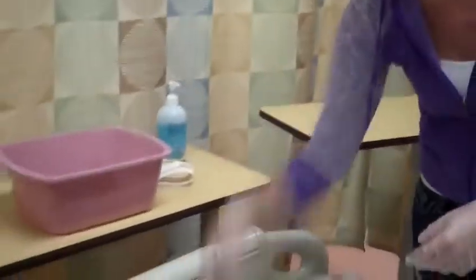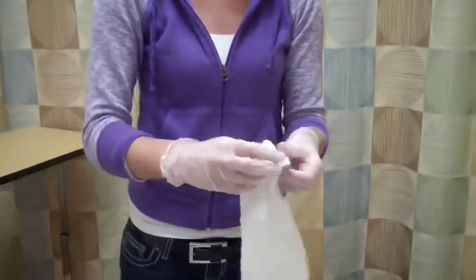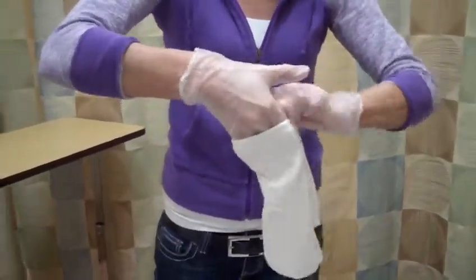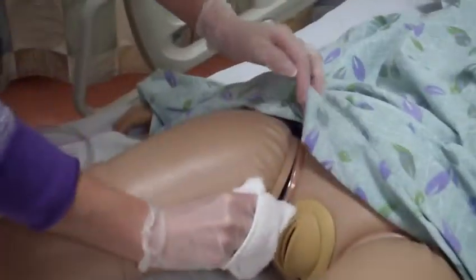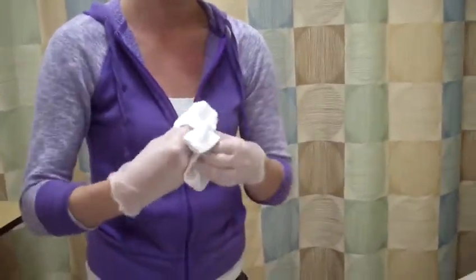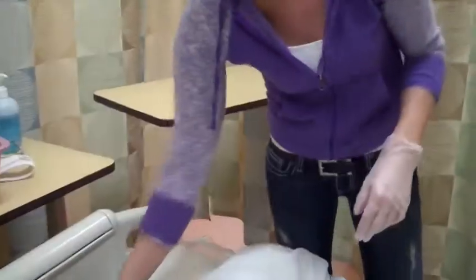I would put that in the dirty linen and grab a dry washcloth. And we're pretty much going to do the same thing. Dry her off. I'm going to dry one side first, front to back. Switch this around. Dry the other side, front to back, without touching it with my dirty hand. And then dry down the middle. Also placing this in the dirty linen.